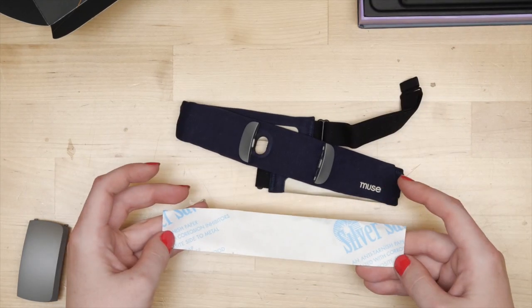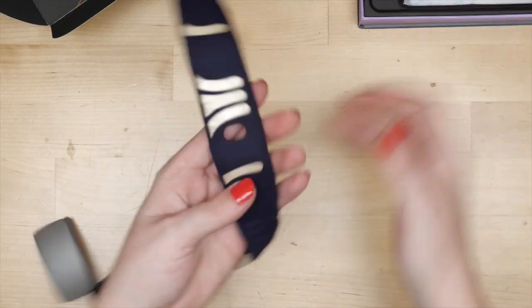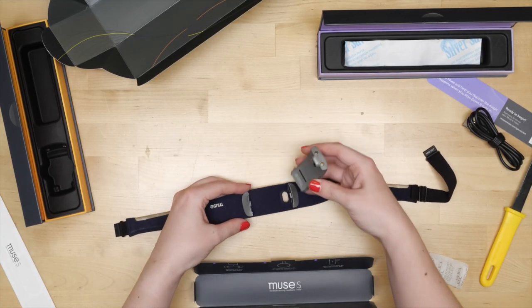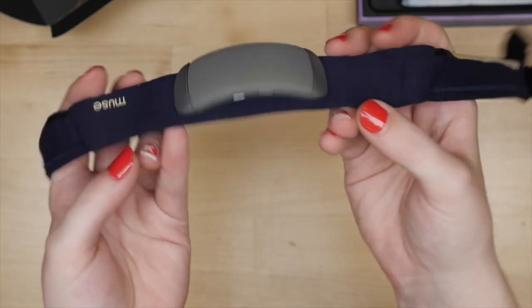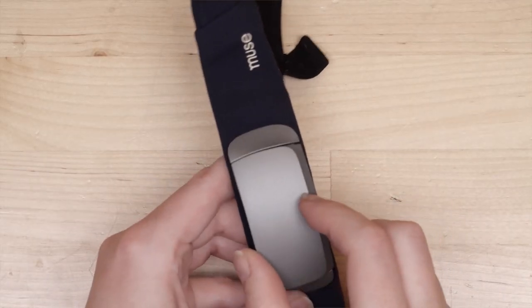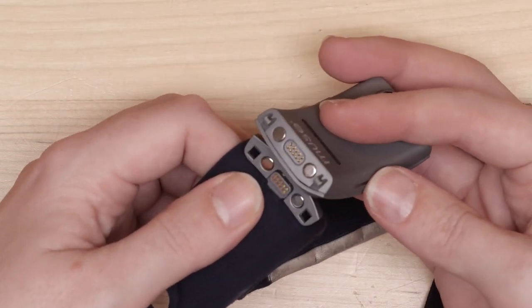Another clue is this anti-tarnish paper that's included in the box with the band. Even without the logo, I recognized that stuff from my silver jewelry selling days. The main circuitry lives in a hard plastic enclosure that attaches to the band with magnets. The band has two hard plastic protrusions that house these magnets, as well as the electrical contacts connected to the fabric sensors.